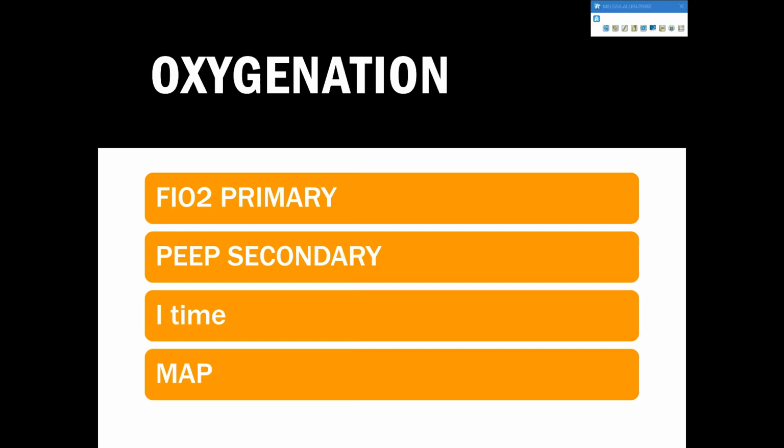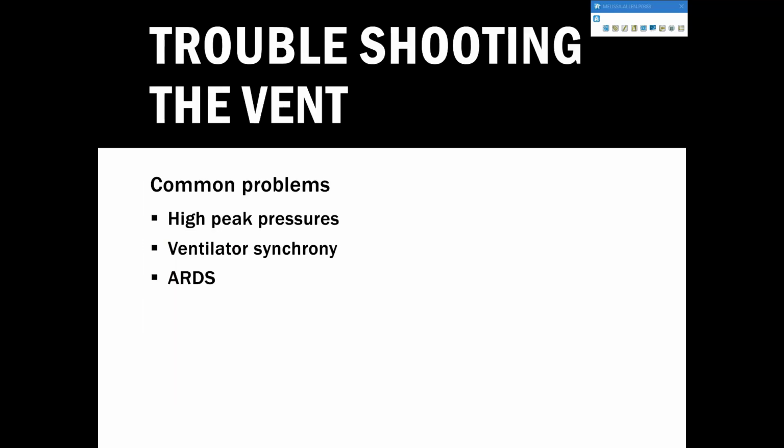And the reason is you're holding that breath in more times. So it's more times per minute. So therefore your mean, which is your mathematical average of your airway pressure, goes up. So just a little side note, but that's obviously picking at straws. That's not going to be one of our go-to tools for oxygenation, but just something to be aware of.